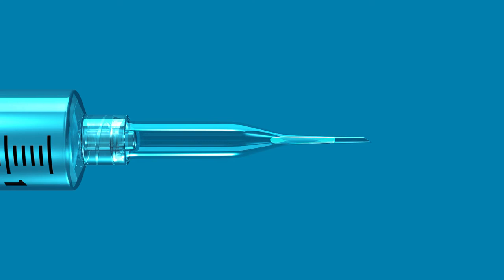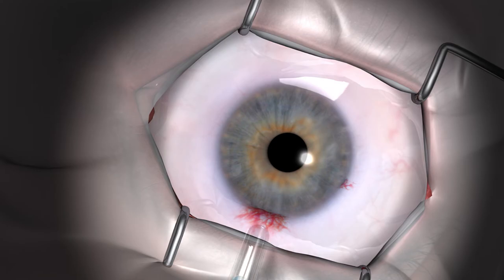Once the graft is positioned in the slender end of the cannula, the graft is ready to insert into the anterior chamber of the eye.